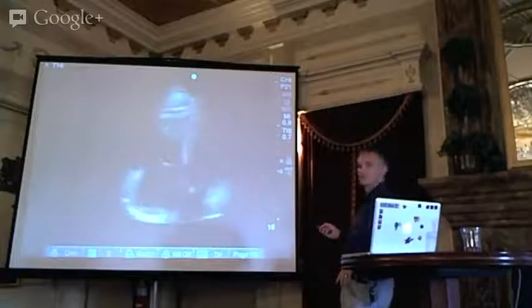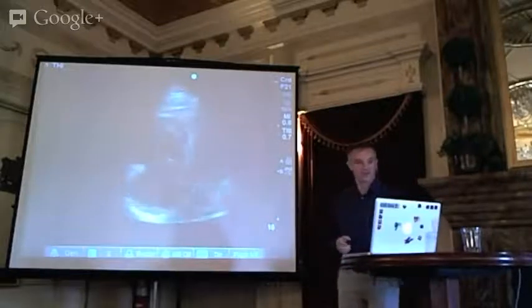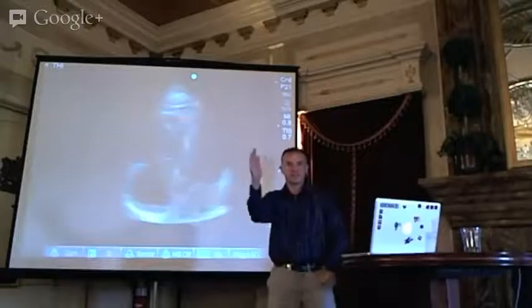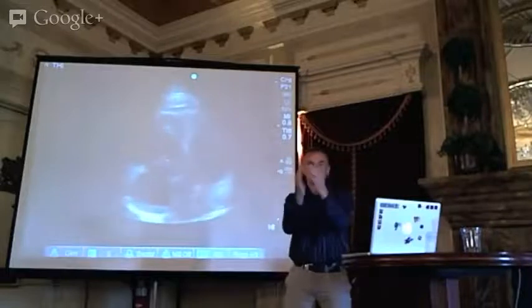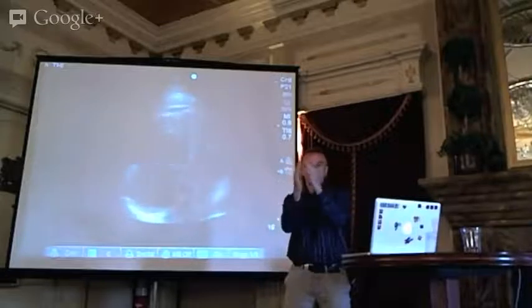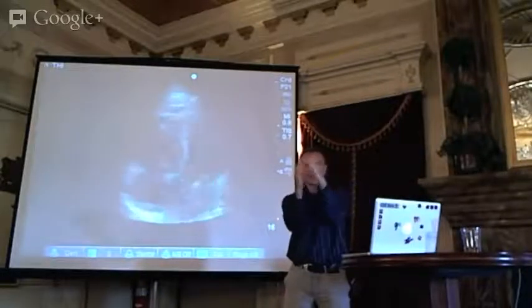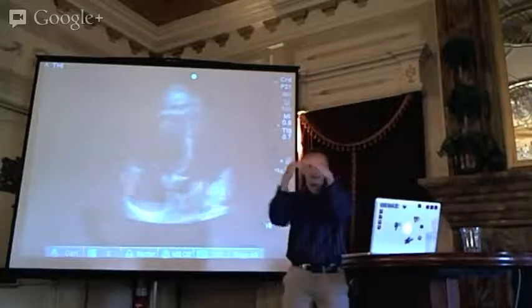So the way the septum is moving is in the opposite direction from where you would expect it to be. I'll explain that. Normally, the opposite walls of the left ventricle in systole go towards each other, and then in diastole go away from each other. If my right ventricle is here, this is my septum, this is the opposite wall of my left ventricle, this is what should be happening. But because of the high right-sided pressures from a PE, at a part of the cardiac cycle, when the left ventricle relaxes, the pressure on the right becomes greater than the pressure on the left. Now it pushes the septum into the left ventricle as the left ventricle is relaxing. So rather than that, you get that paradoxical septal motion.